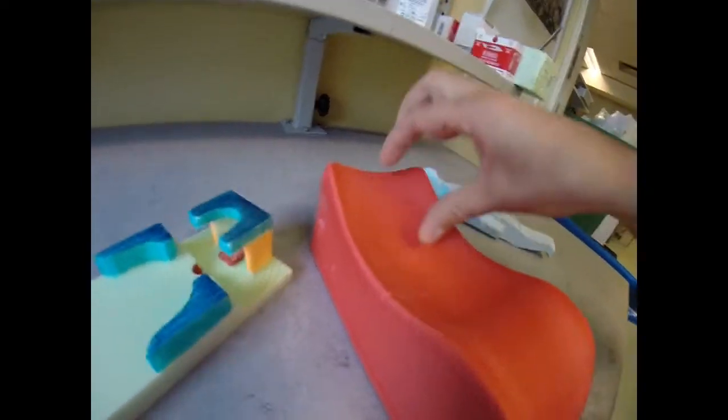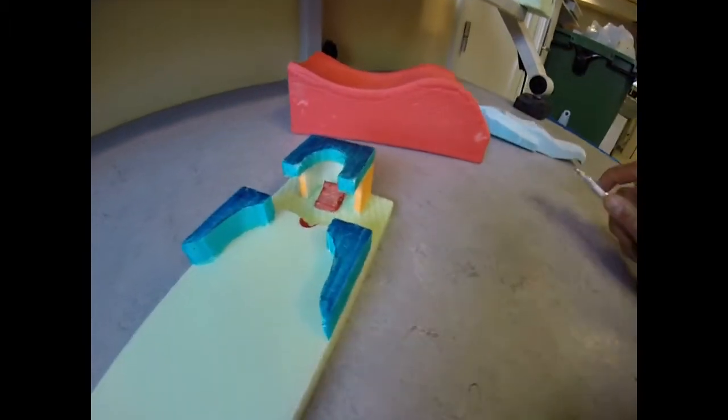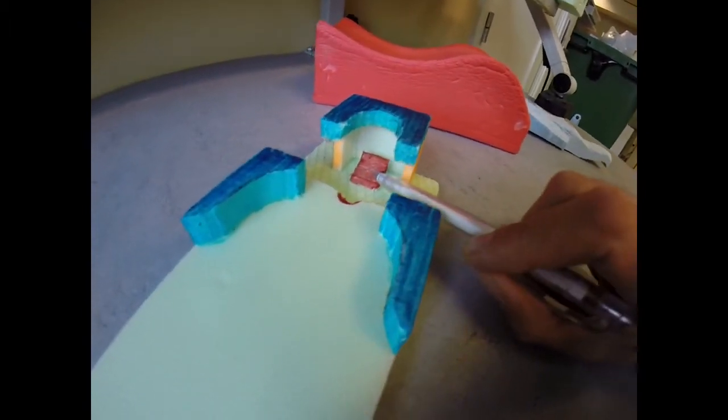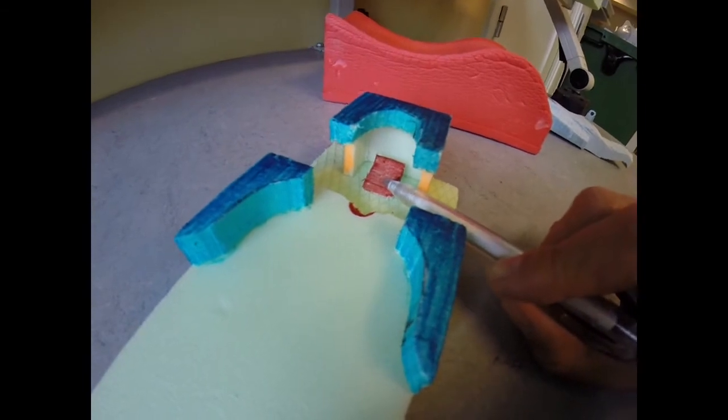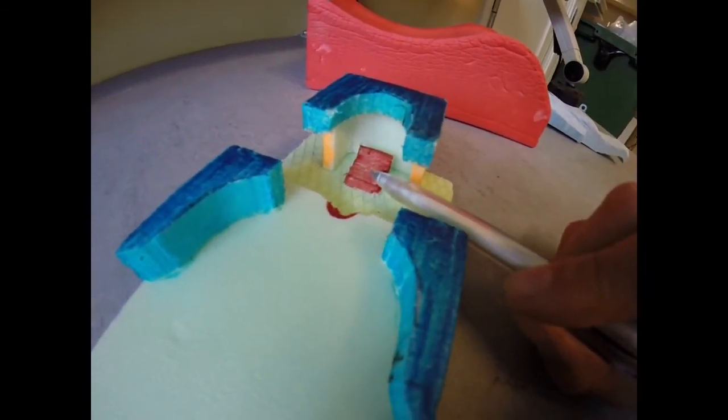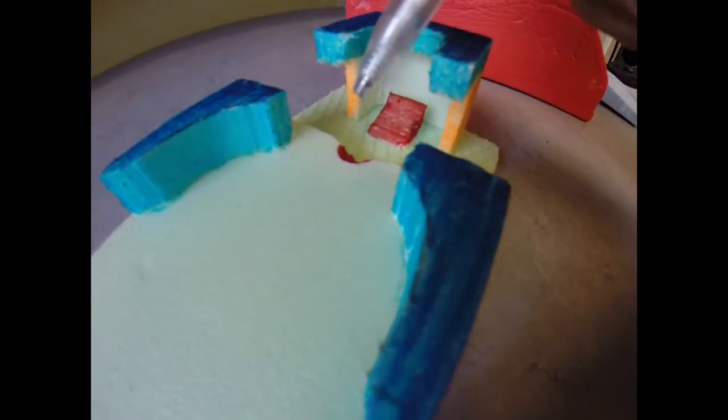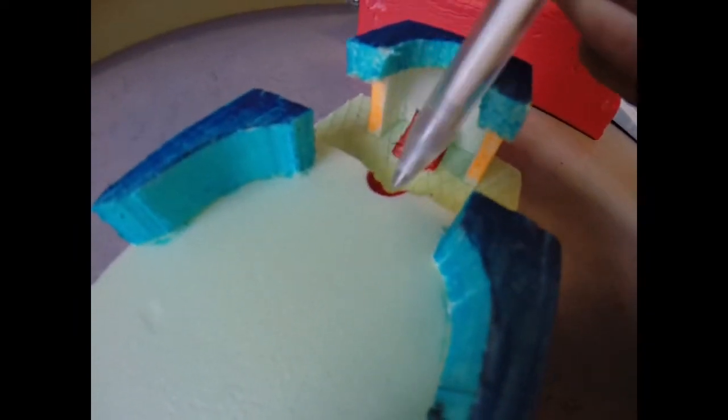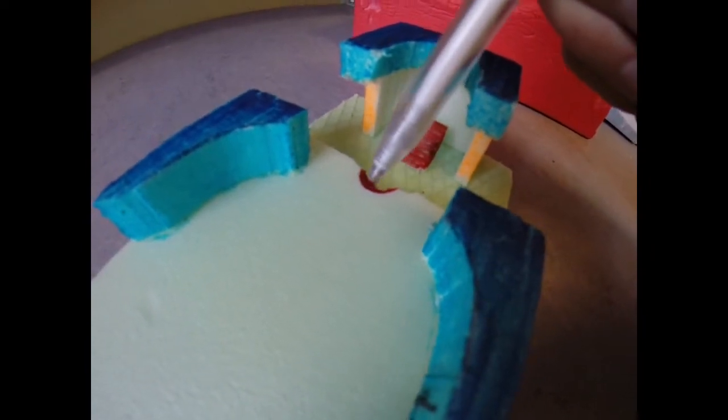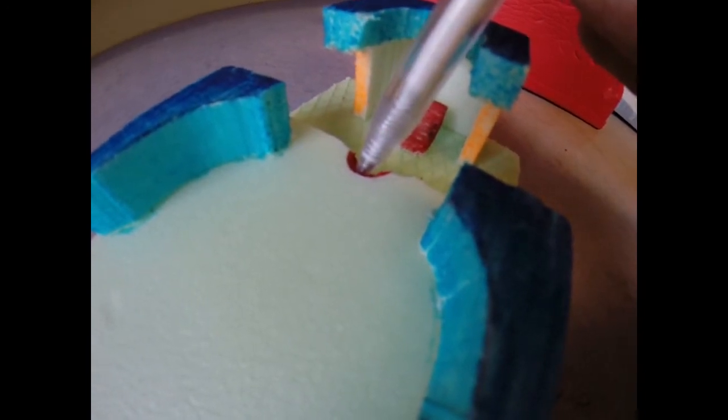And this part was glued here and this was to support the forehead. They made a little hole in the polystyrene and this was to support the chin.